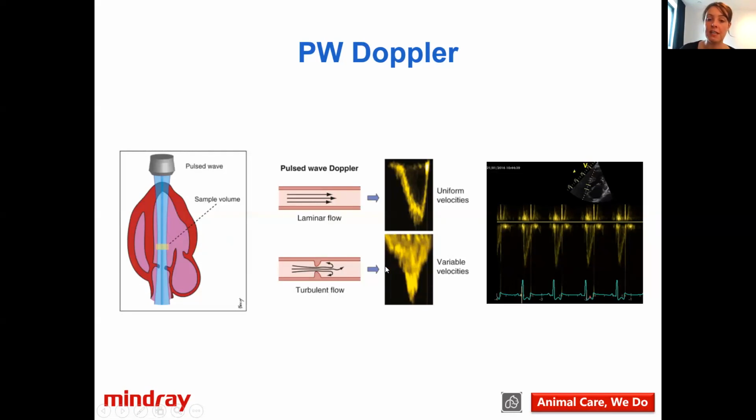With this, I have to say that if your pulsed wave Doppler is not positioned perfectly in the middle of the vessel and you are a little bit more against the wall, for example, you will also get this result. So it's important to understand that it's not because you don't have the perfect velocity profile that looks hollow that it's immediately pathologic. It can also be a little bit of artifact. This does not immediately mean that there is a severe pathology in the vessel.